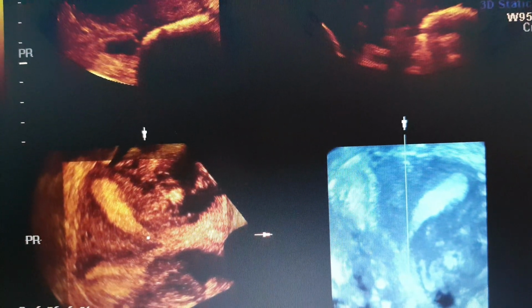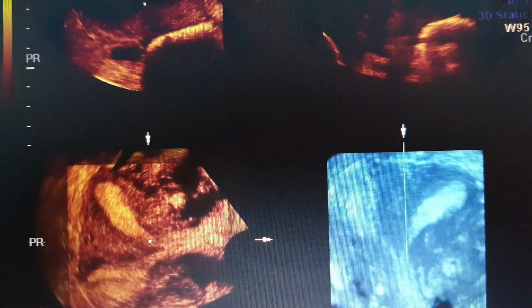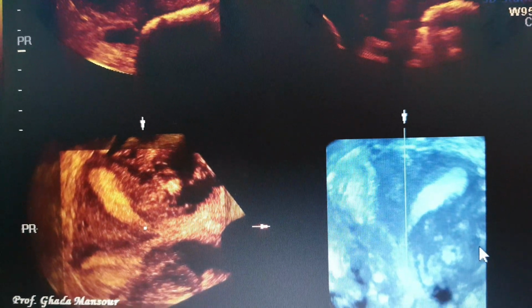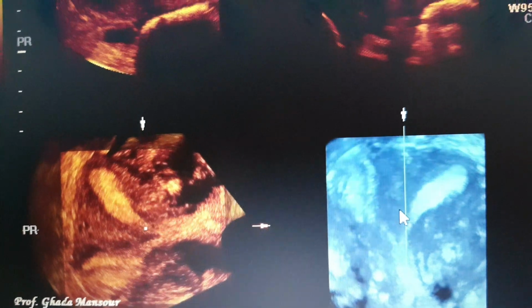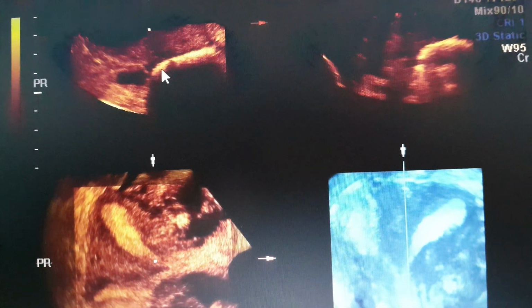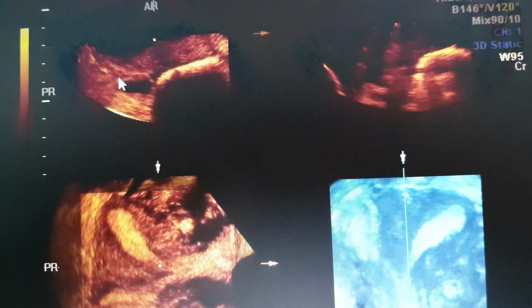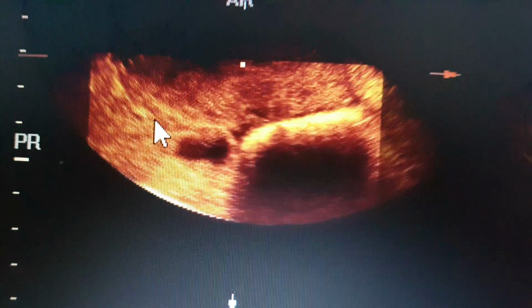Considering this picture, my dear colleagues, followers of obstetrics and gynecology ultrasound for all page, unfortunately, I had many answers for this picture as bicornuate uterus, and this is not right. Simply, of course, when you see the ultrasound or the transvaginal approach for this uterus, you'll see it as just a normal uterus. But here I'm using the 3D orthogonal planes.